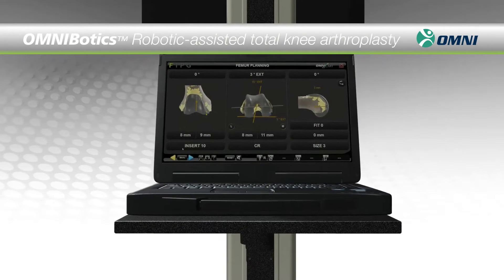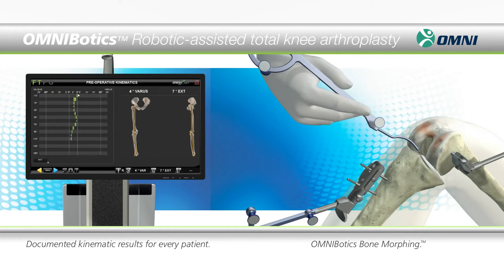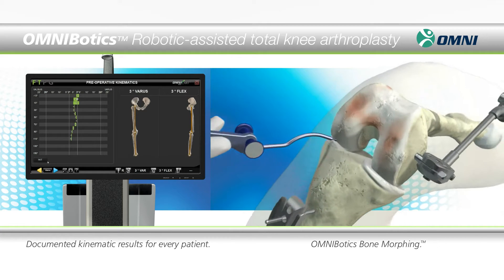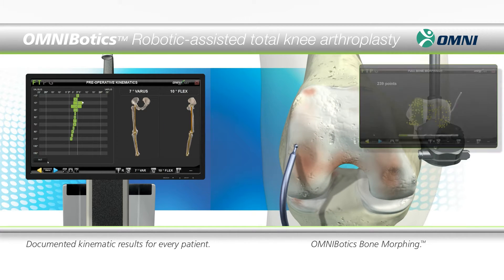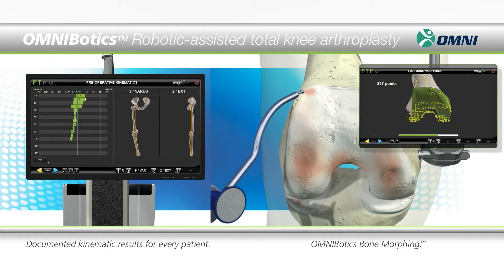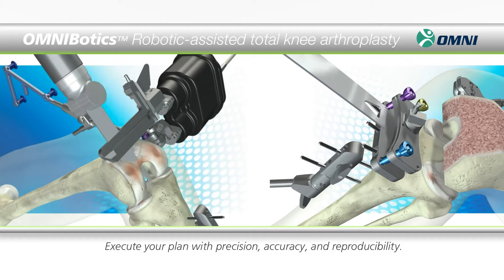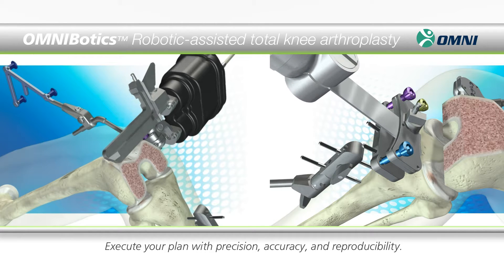The Omni Robotic Assisted Total Knee System allows you to plan and execute total knee replacement procedures based on the requirements of your patient's anatomy. You can document kinematic results for every patient, perform detailed mapping of the knee with Omni's patented bone morphing technology, and execute your plan with a high level of precision, accuracy and reproducibility.